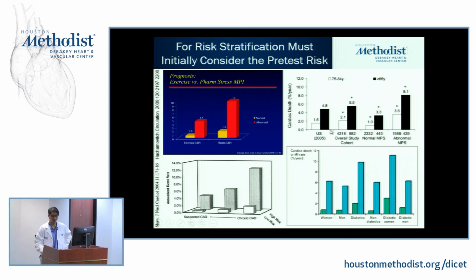You can see a normal study here, again, portends a higher risk than someone who's younger with a normal study. And then finally here, diabetics, you can see those patients who have diabetes. The green here is normal. They have a higher risk than a non-diabetic who has a normal study. So there are patient population groups where a normal study does not necessarily mean less than 1%.